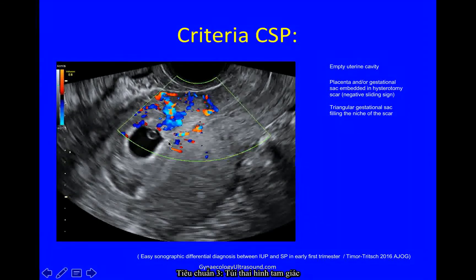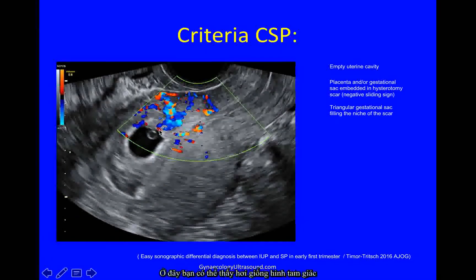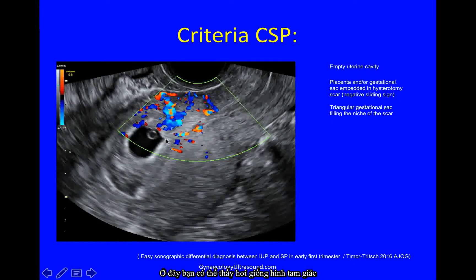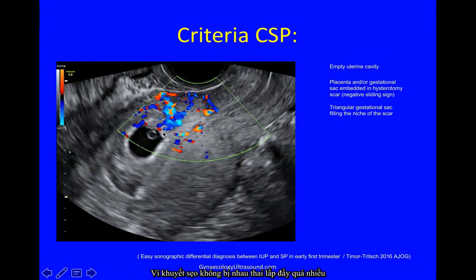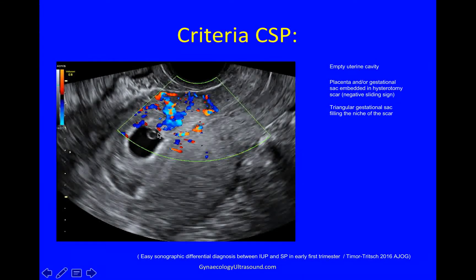A triangular gestational sac — here you can just see a little triangle. Sometimes that is more obvious than other times because the niche of this scar is in fact filled with trophoblast and not so much the sac itself.